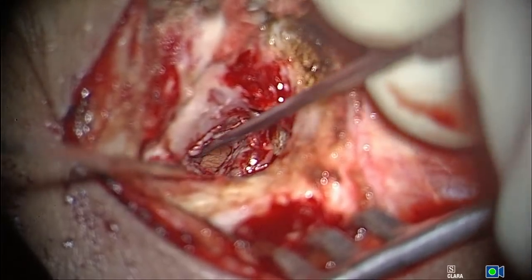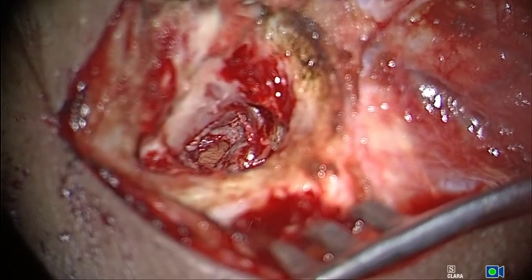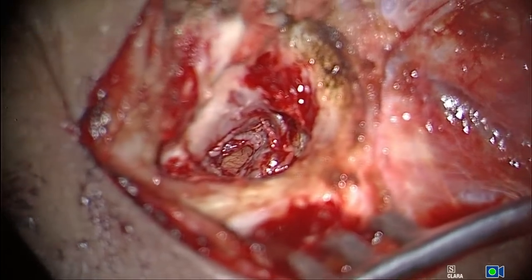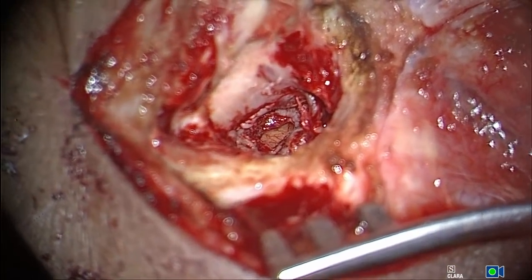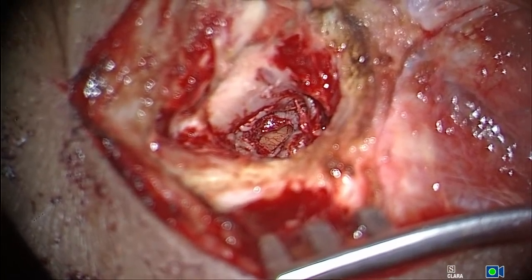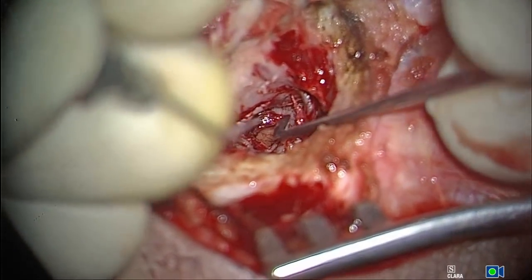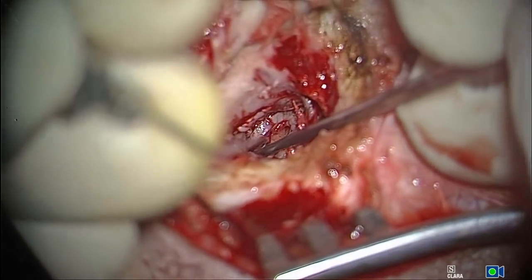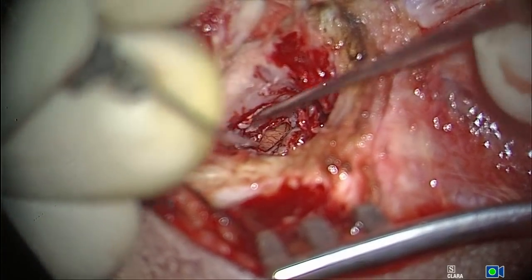See how nice the perforation looks. It looks beautiful. The vessels are seen over the promontory, and this is a case where I will never even think about blocked ventilation. Good middle ear mucosa, I have no block in the ventilation or anything like that.